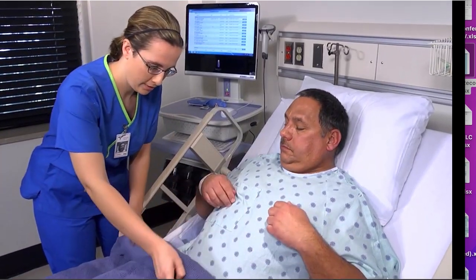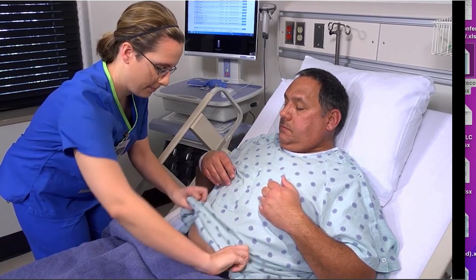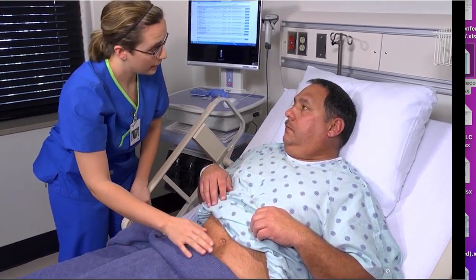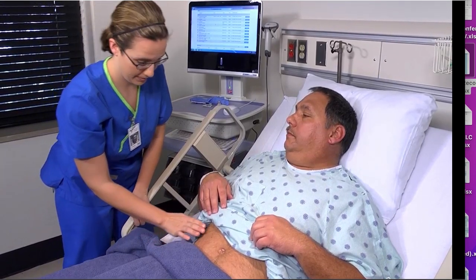Then determine which site you'll use. Shift the patient's bed linen to expose only the potential injection site and surrounding area. Inspect the area for bruising, inflammation, and edema. If the skin is bruised or shows signs of infection, use a different site.